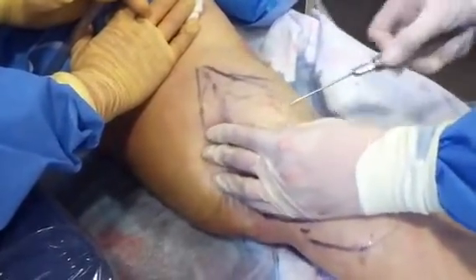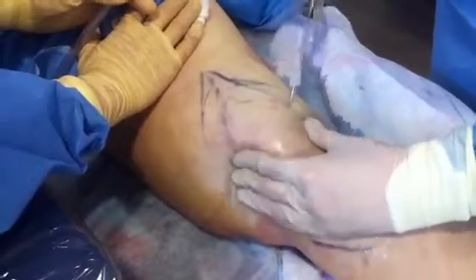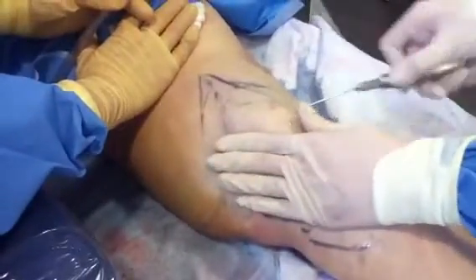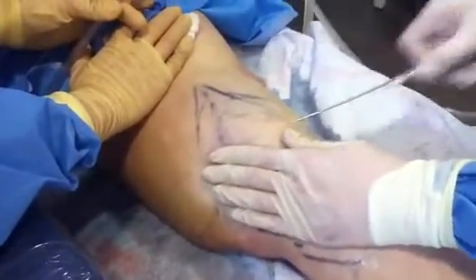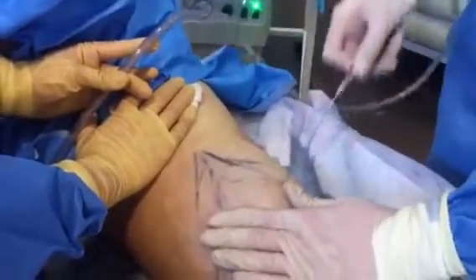The patient's saying there's a lot of fat in there, and we're just going to continue through and take it out. You can see that the fat itself is just a nice, really pretty yellow color. This is really a bloodless procedure.